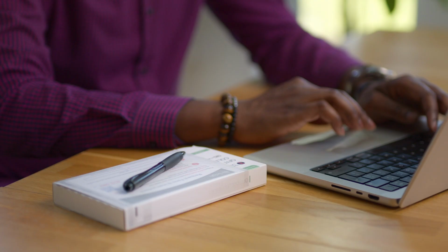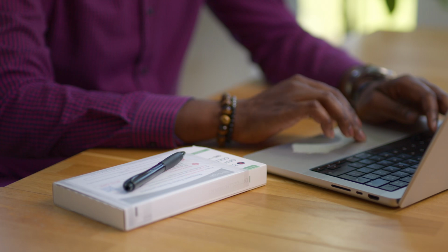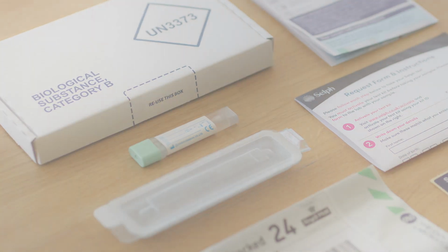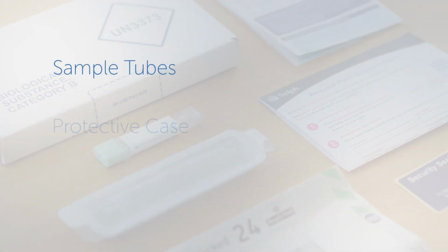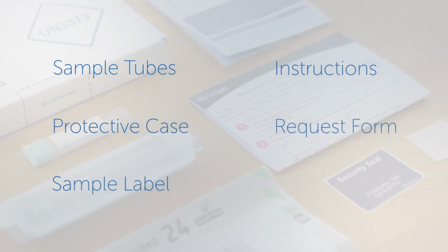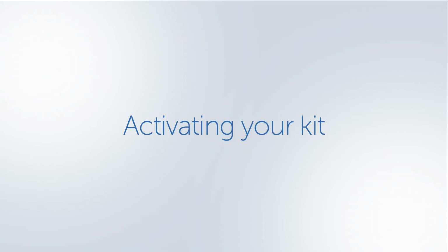I'll talk you through how to do a Selph stool test. You'll need your self-test kit, access to the internet and a pen. The whole process shouldn't take more than about 20 minutes. If you can, it's best to take your sample in the morning on Monday to Thursday. In your kit, you'll find one or more sample tubes with a protective case, a sample label, instructions, your self-test request form and a return envelope.